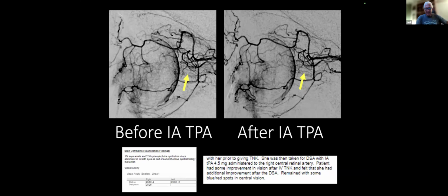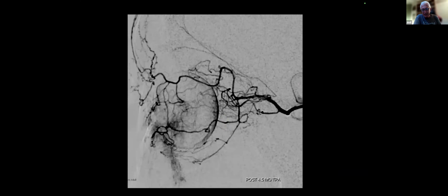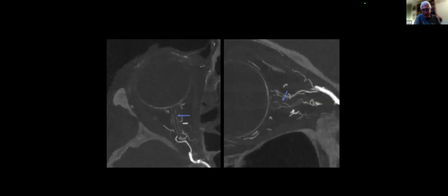Beautiful. Two questions. One, you showed that there was a reconstitution of that artery before, so why would it need to be reopened? Second, apropos of the DMSO toxicity, how about contrast toxicity in such a small artery, in such delicate territories?